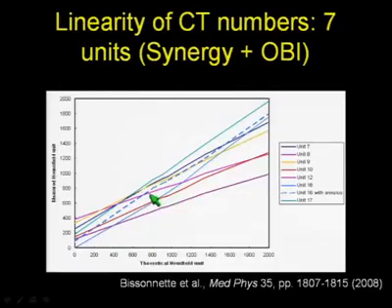So at this point, if people are interested in using CT numbers straight away from Cone-beam CT, I would advise them caution. The CT numbers are not stable and are dependent on the scatter condition. If people want to use Cone-beam CT images for planning purposes, they will be geometrically accurate. CT numbers may not be, so I would advise using bulk density correction and performing those calculations on that rather than on CT numbers.